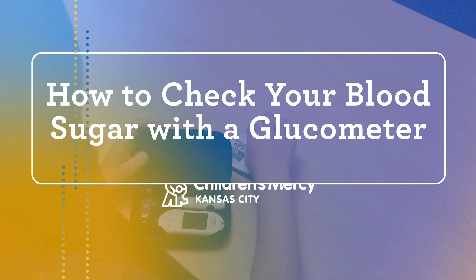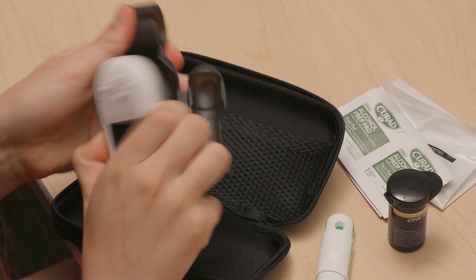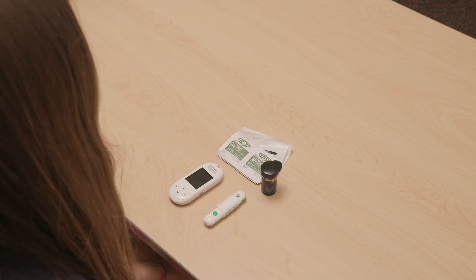Hi! Today I'm going to show you how to check your blood sugar with a glucometer. A glucometer is used to check blood glucose levels. It measures how much glucose, or sugar, there is in your blood. A glucometer can also be called a blood glucose meter or a blood sugar meter.